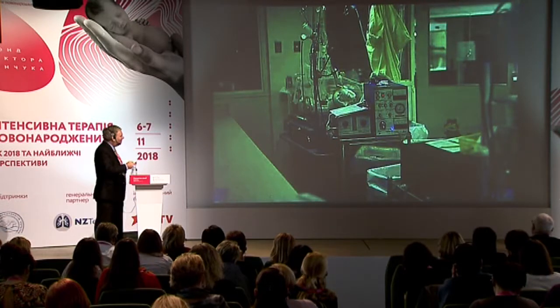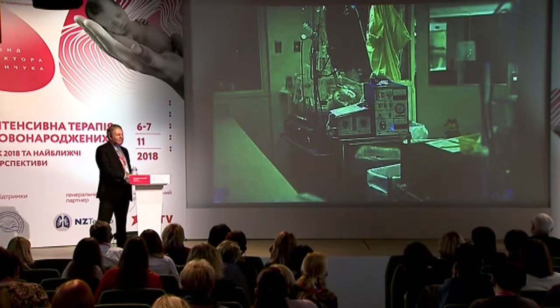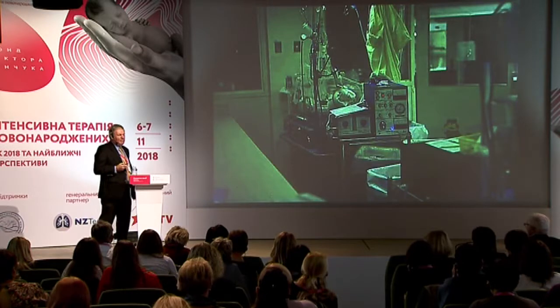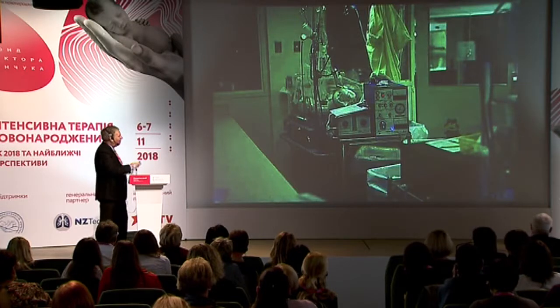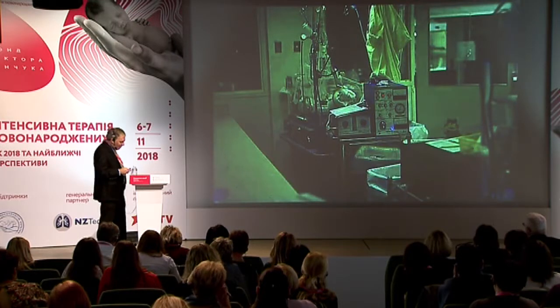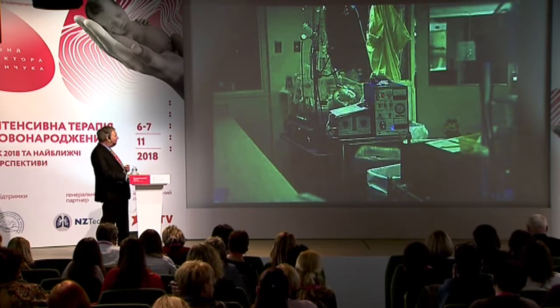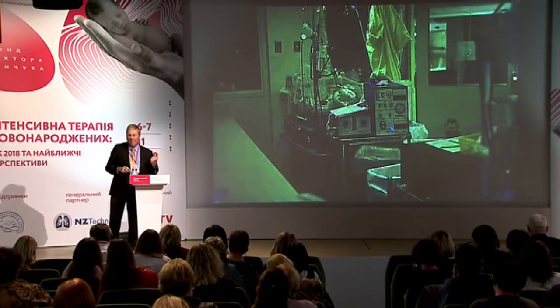The people that loved it said, I can ventilate a baby much better with this device than I can the typical Baby Bird, the ventilator I showed you earlier. And those that hated it said, this device is uncontrollable, and every time we put a baby on it, they develop a pneumothorax or they die. And usually what happened is this device was kept in a storage cabinet, and the baby would not do well on the time-cycled pressure-limited Baby Bird ventilator, and somebody would say, you know, maybe we should try the Bourns volume ventilator on this baby.